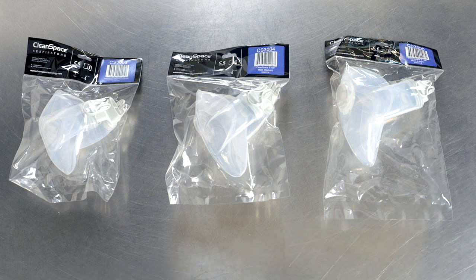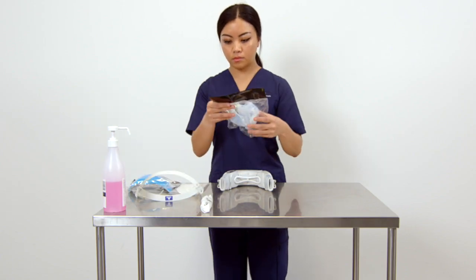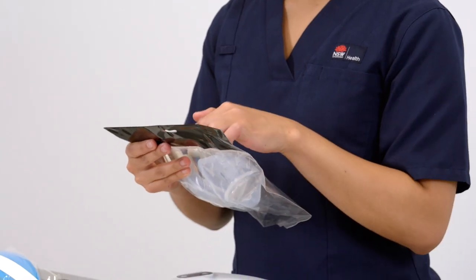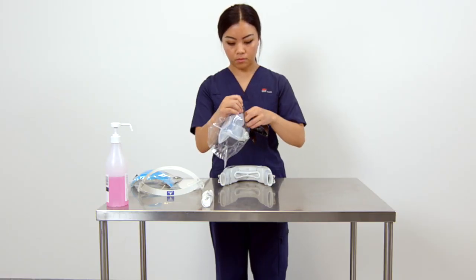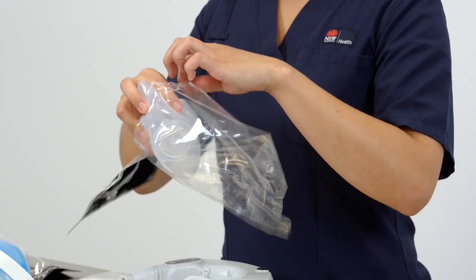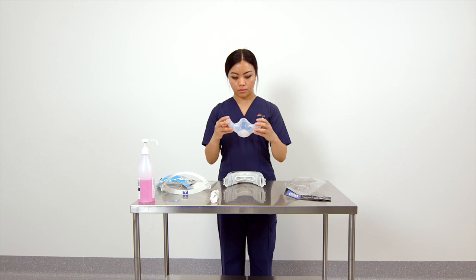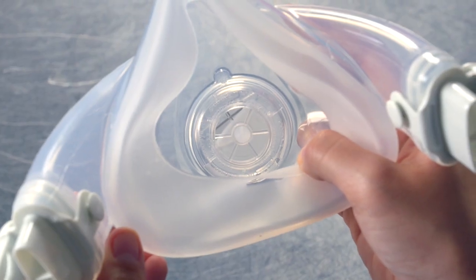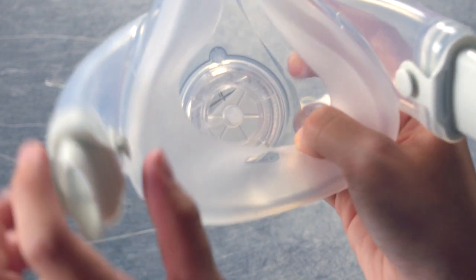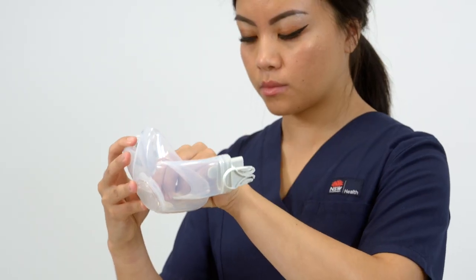There are three sizes of the PAPR facepiece or mask: small, medium, and large. Check that the mask is the correct size fitted for you during your fit check, then remove the mask from the pack. Check that the exhalation valve is in place and the silicone leaf is not folded. If it is folded, twist the conical piece on the inside of the mask until the leaf sits flat in the exhalation valve.